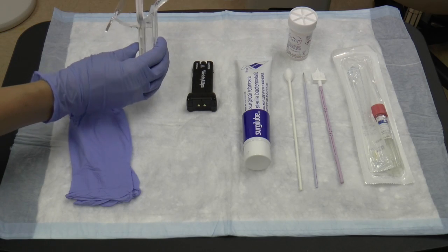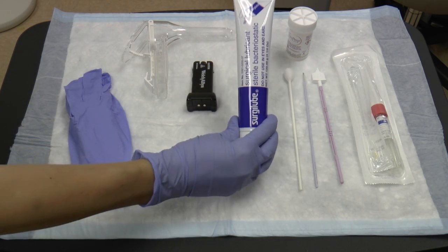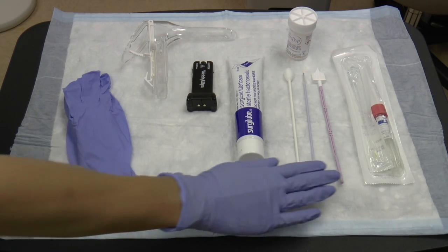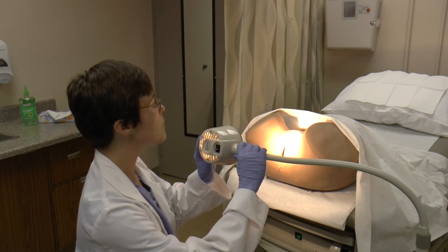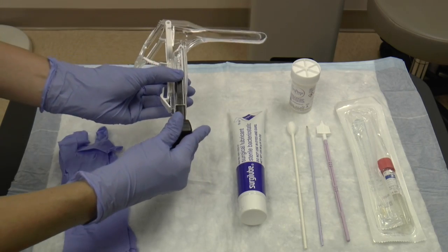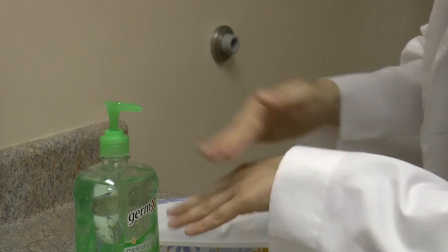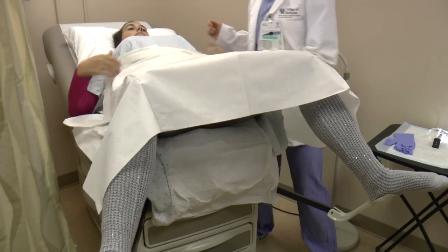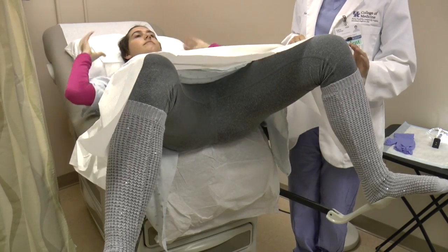Place your supplies within easy reach: speculum, lubrication, gloves, and any indicated tests. Ensure your light source is functional. Your facility may have a gooseneck lamp or a light attached to the speculum. Always clean your hands. Help the patient into the proper position on the exam table. If your facility provides a pillow, move it under her head.